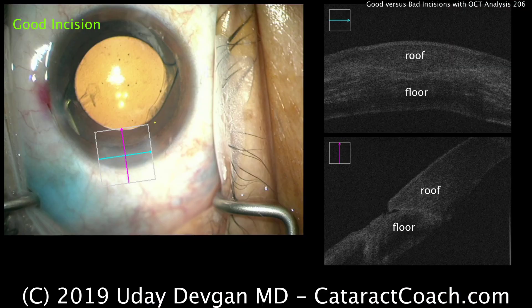Looking at the two-dimensional OCT view, you can see the roof and floor are the same and balanced. And the incision seals well.